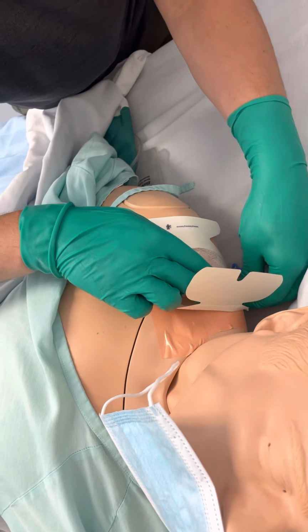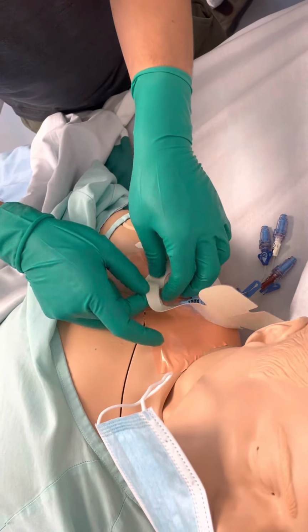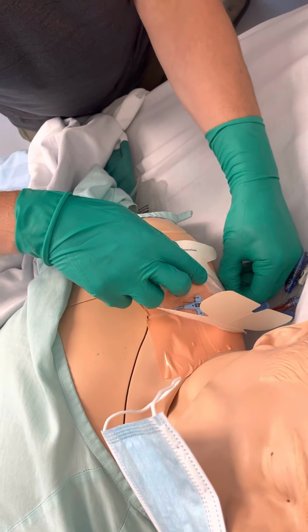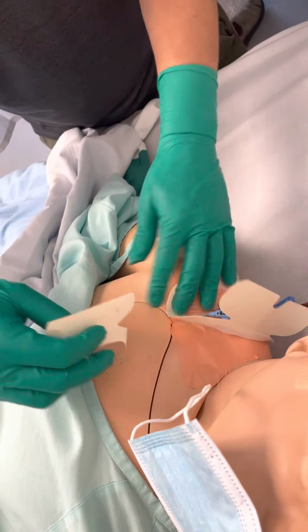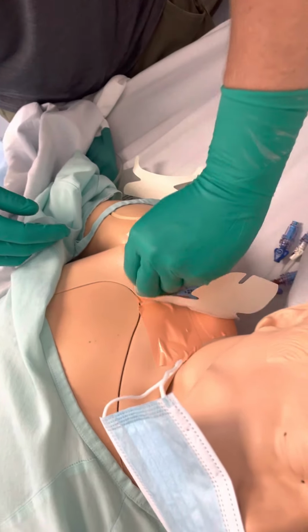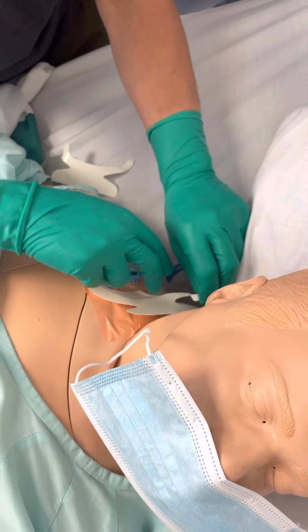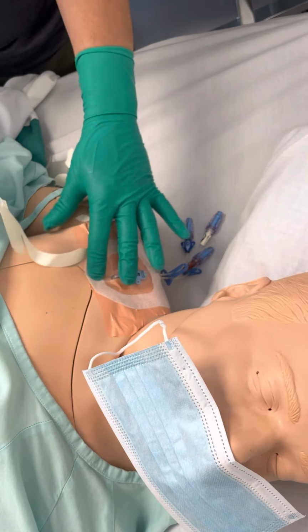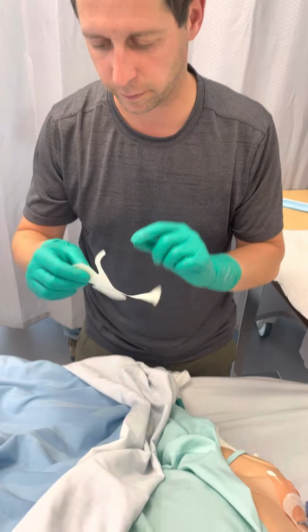You doing okay, Pat? We're almost there. The bed would be a little higher. Here we're just not taking the time for the exercise here. There we go. Do you want to make sure that this is in here correctly? And we want to smooth this down, make sure it sticks really well. There we go, Pat. Because it's a little bit wet, it might not stick as well as it would on human skin that has been dry. Second one we can do. There we are. Okay.